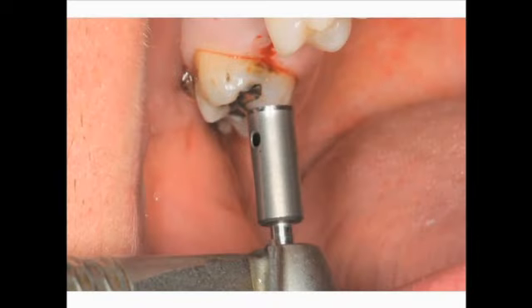A sharp tissue punch blade removes the soft tissue at the surgical site and eliminates the need for a full thickness flap. So this is truly a flapless procedure. Sutures will not be required following implant placement. Remember, bone is not innervated. There are nerves that run through bone, but there are no pain receptors in bone. The only discomfort that the patient would feel is the small incision made in the soft tissue. So most of our patients will only take a Tylenol tablet postoperatively. It really is not a painful procedure.